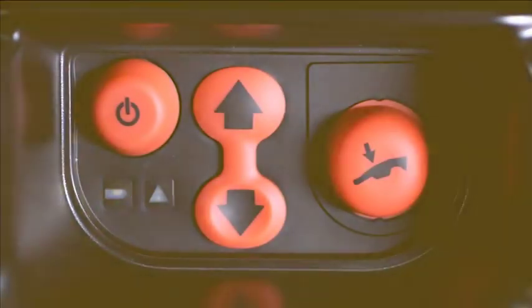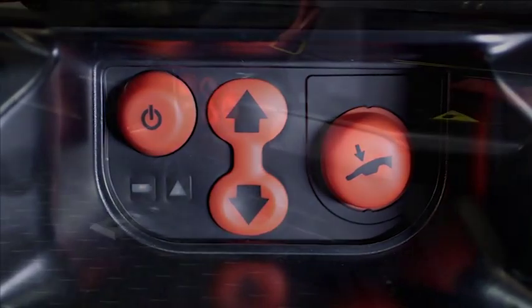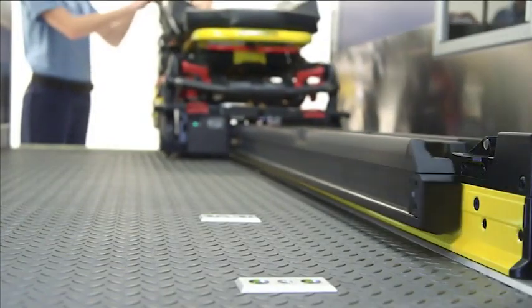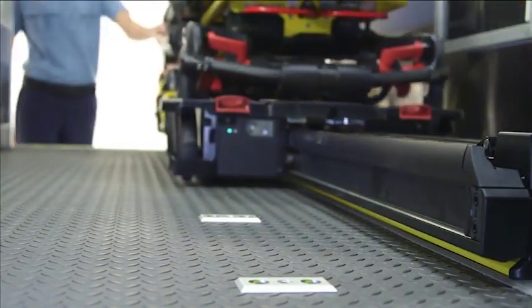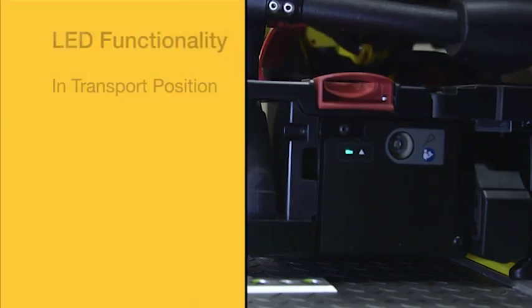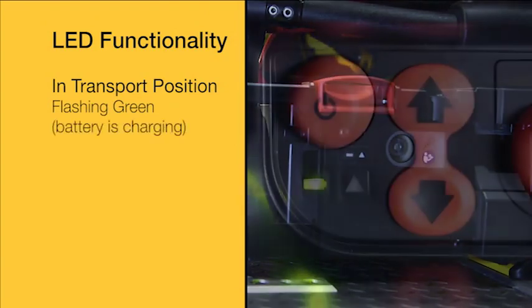The Power Load system has been designed with a control panel located on the patient left-hand side with a duplicate LED indicator at the head end of the trolley. These LEDs display the status of the Power Load battery and system. If the Power Load system is in transport position, the battery LED will flash green, indicating the battery is being charged.